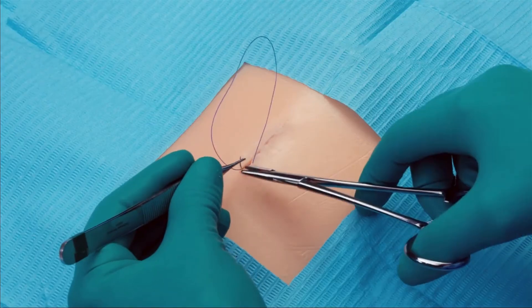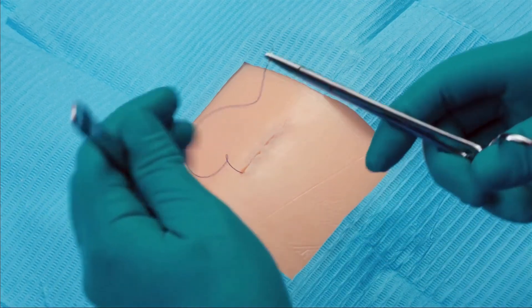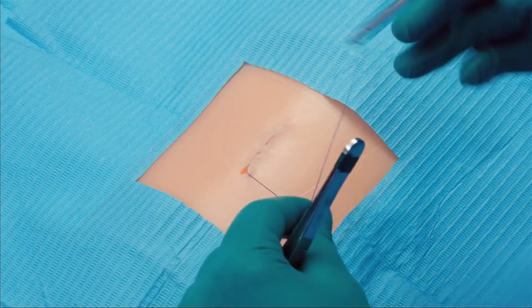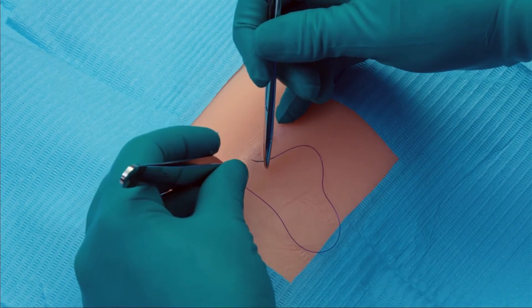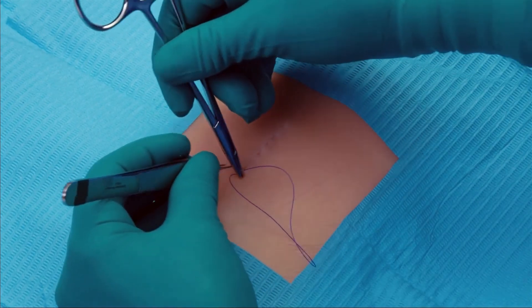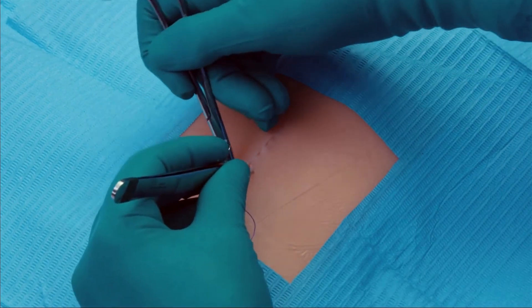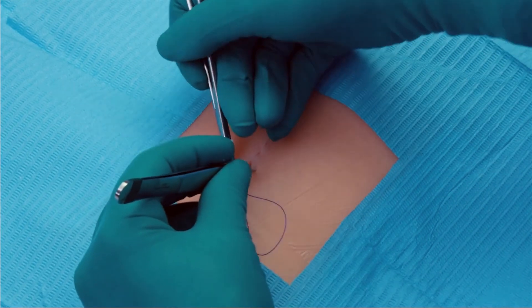Okay, coming to the very end here. I'll come out, and then I'm going to do the reverse. Once the apex has been reached, make the appropriate backstitch towards the midline of the incision.